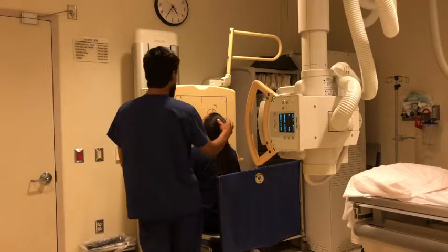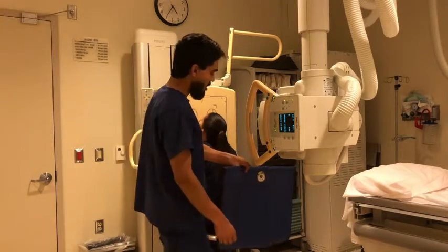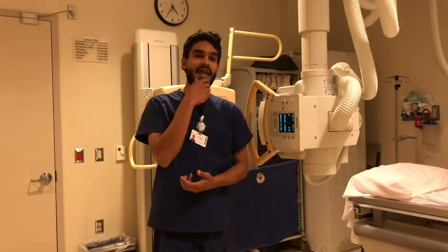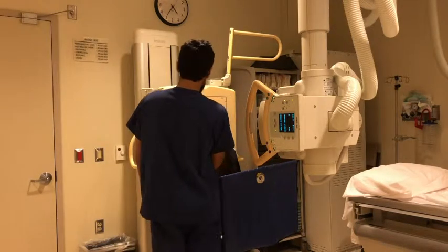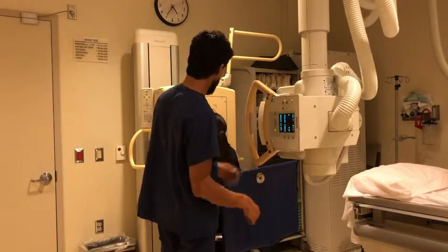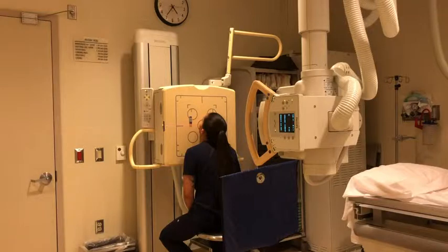All right, good, right there. Stick your chin all the way up. Still got the left marker on the board. I'm using the lead shield, and we're going to shoot this image at 85 kV and 8 mAs. Alright, let's go shoot the image. X-ray.